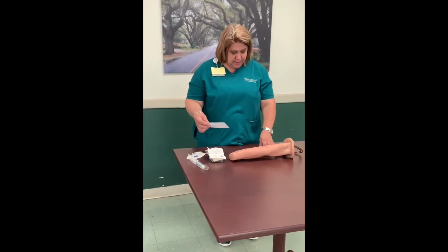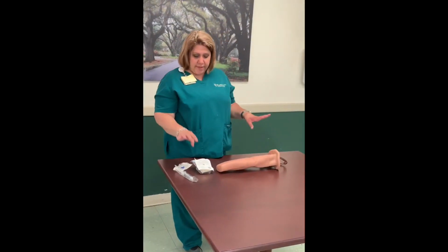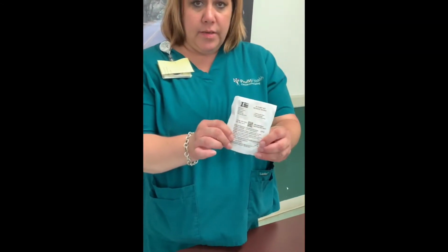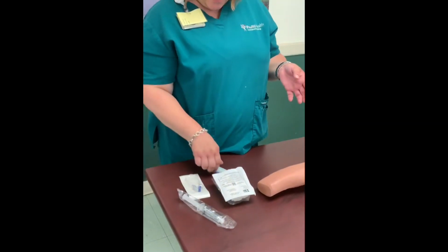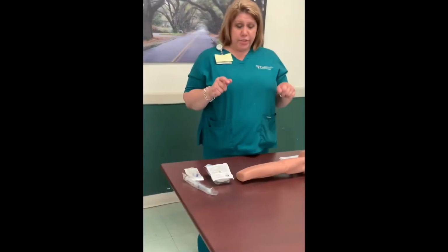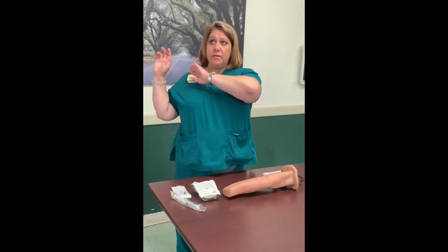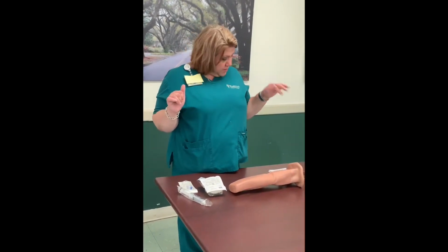So that's all of that. The steps we're going to go over: you want to gather your materials before you go into a patient room, which I have here in my little handy dandy IV kit. My flush, my extension tubing, and an IV catheter needle. So you go into the room, knock on the door, introduce yourself. You wash your hands. If you had an order to give IV fluids, you would go ahead and prepare that, but we're not going to do that. We're just sticking to the IV insertion.